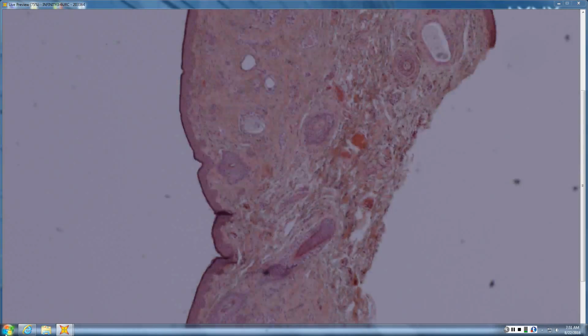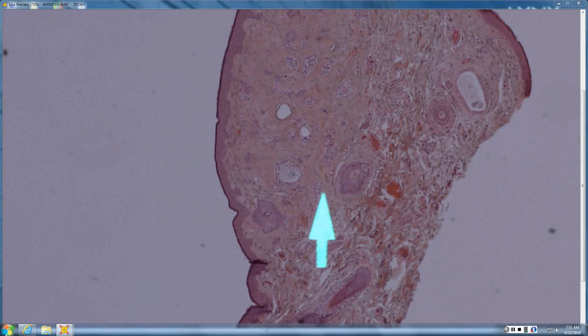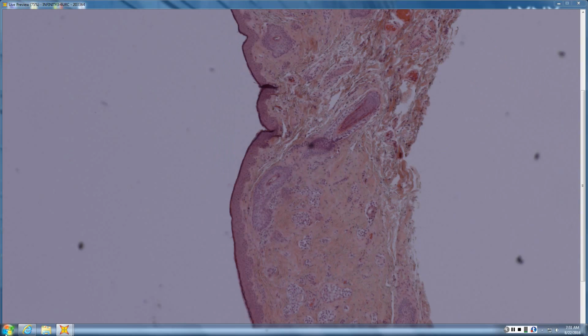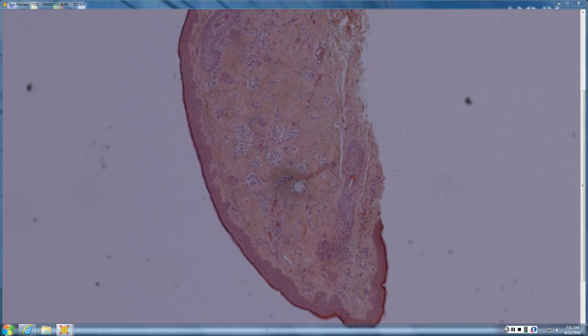So this is a small pea-sized, actually they're like two peas side by side here, two peas in a pod. So you got two little peas of sweat ducts in a sclerotic stroma. All of the Paisley tie neoplasms have a sclerotic stroma. So in this case, you can see that it's a little BB-like thing, so you know it's a syringoma. But if you only have the top of it shaved off, then you need clinical pathologic correlation.